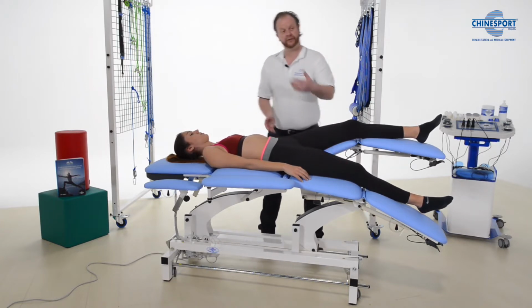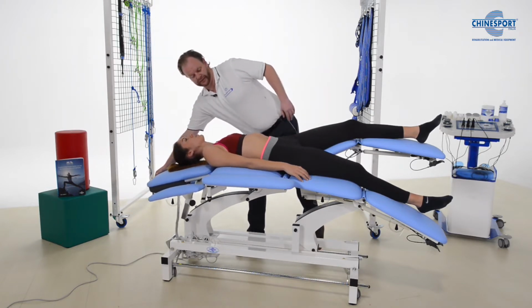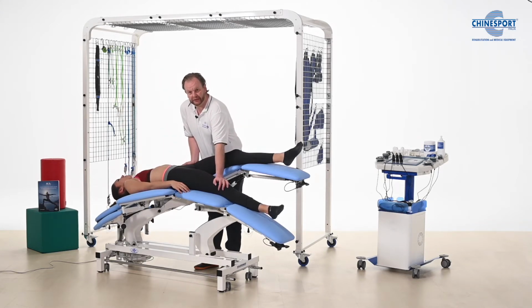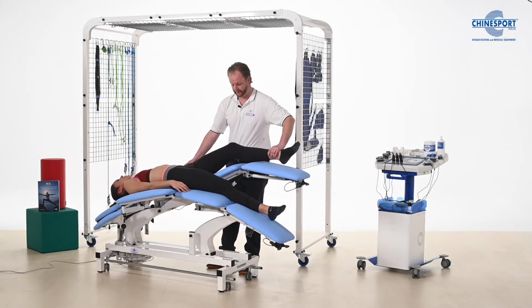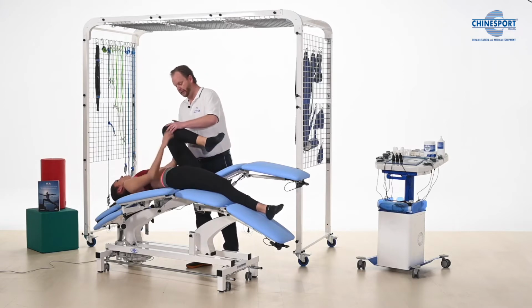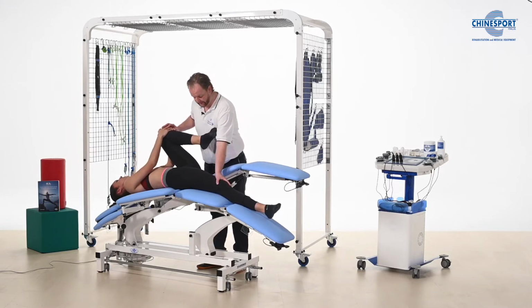And if we want to do a little bit more stretch, we can obviously lower this part of the table. We have some more stretch in the psoas. And if we want to increase that even more, we can bring up this leg. We have more. And if we want even more, then we can go here. And she's actually starting to lift off here from the table.